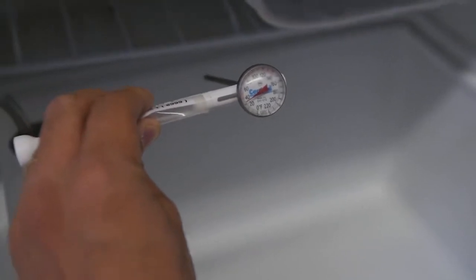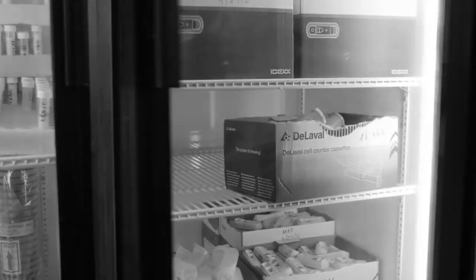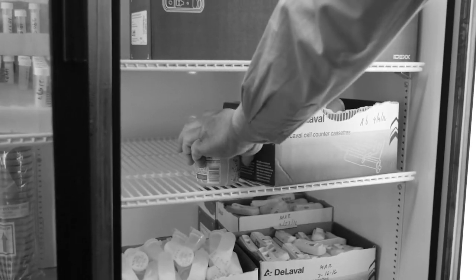Record the temperatures for each refrigerator twice a day, both morning and night. Only use these refrigerators to collect and store milk samples. No food, beverages, antibiotics, chemicals, drugs, or any other items not related to the samples or sampling procedures may be stored in this refrigerator.